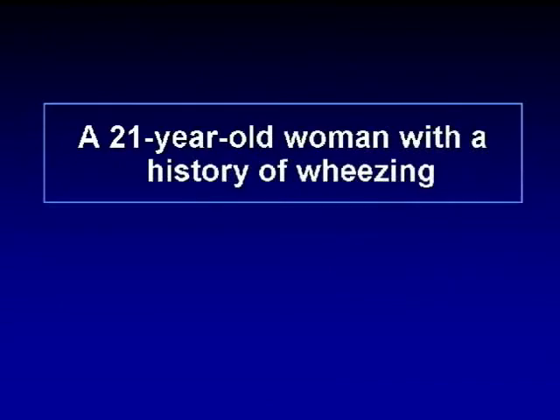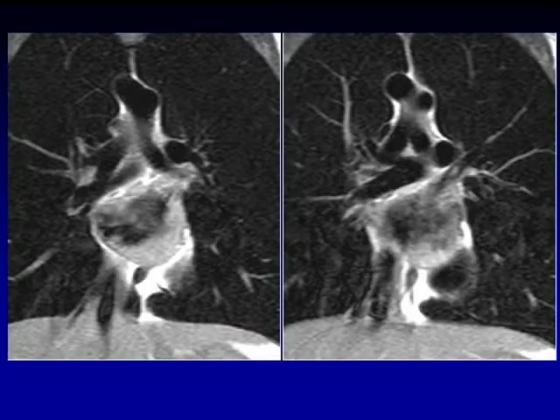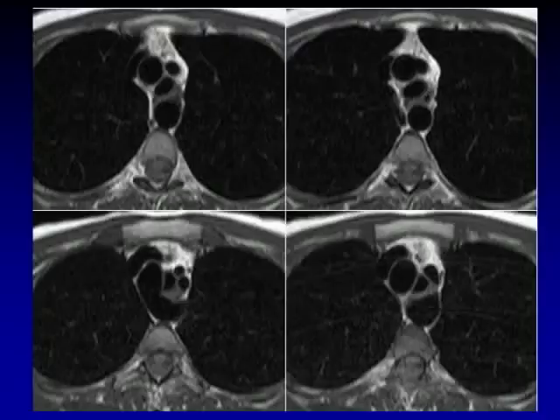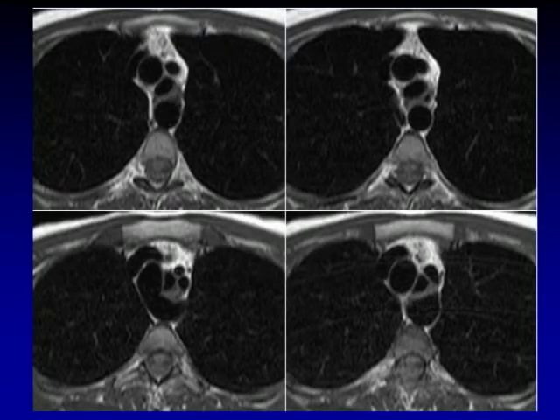Next case: 21-year-old woman with history of wheezing. These are coronal black blood images, and we also have some axial black blood images.